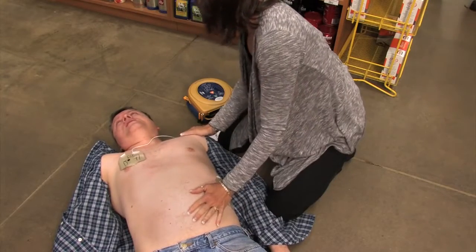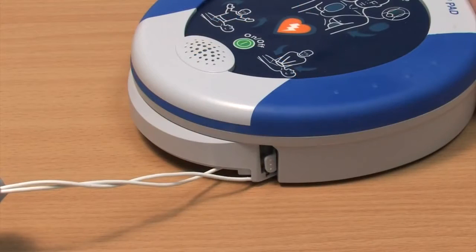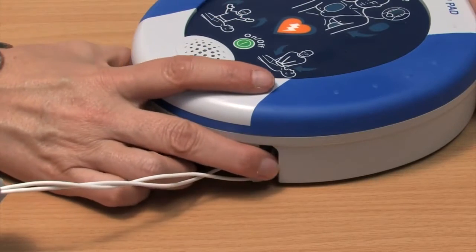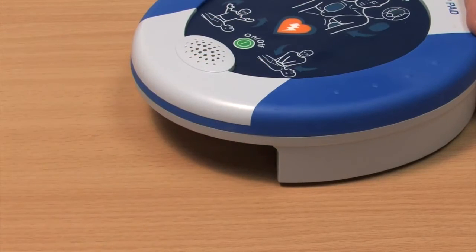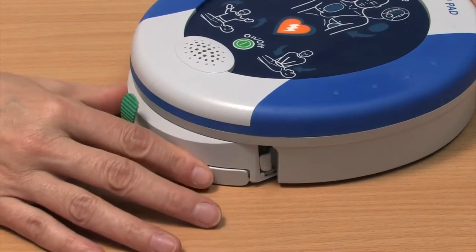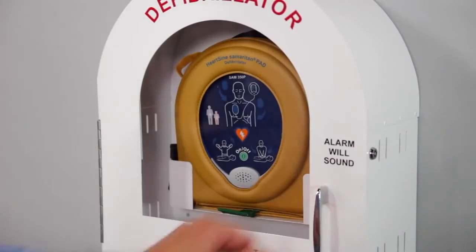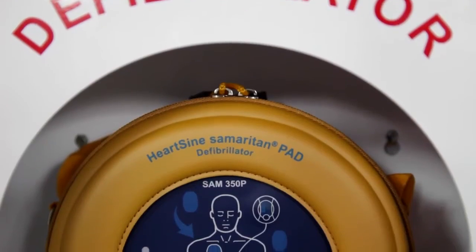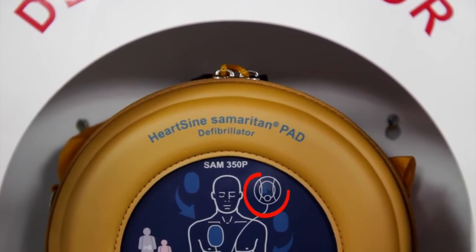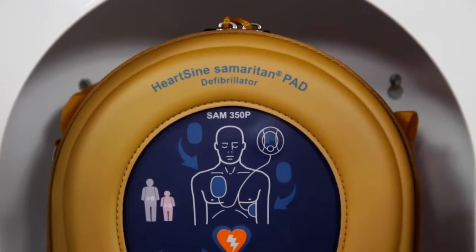One note for rescuers: the Samaritan PAD can be used while in its protective case or out of it. After using the Samaritan PAD, contact your HeartSine channel partner to purchase a replacement pad pack. Slide a new pad pack into the unit and store it as usual. Remember to follow your local battery disposal guidelines. Periodically check that the green light is flashing so that you know the unit is ready in case of an emergency.